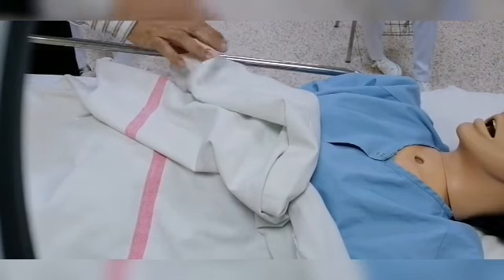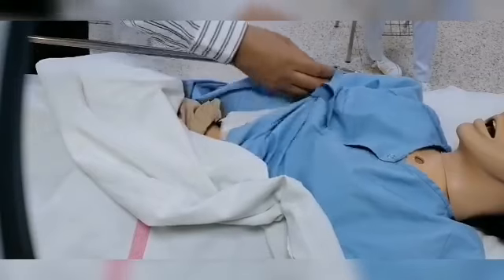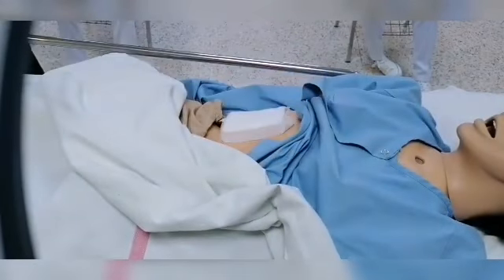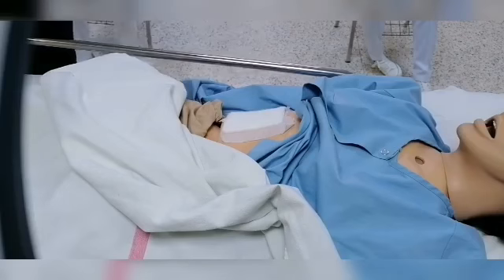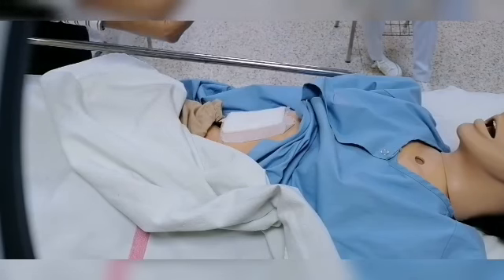We have to expose the dressing to find out where the site of the wound is. So here, the client is having a wound in his abdomen. It might be a post-operative surgery. What do I have to do before removal of that wound dressing?